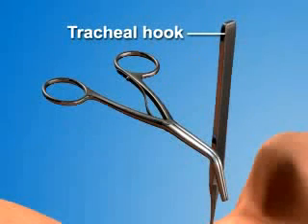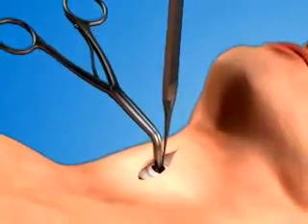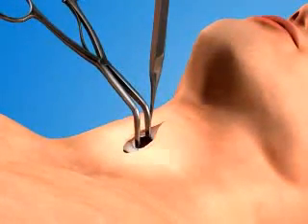While holding the hook with your non-dominant hand, use your dominant hand to place the troussodilator into the trachea. Spread the blades open to dilate the opening in a vertical direction.